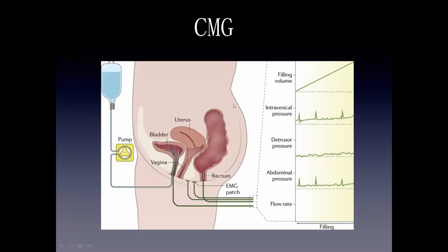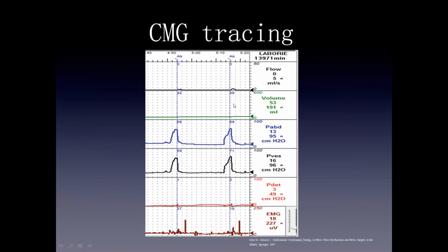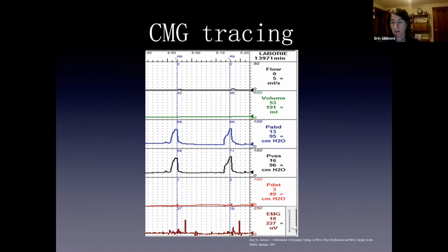Is there a time when I do ask the person to cough and do the Valsalva? Is there a specific moment? Yeah, so usually, obviously most people aren't going to leak when their bladder's pretty empty if they have stress incontinence. So once we have about 150 cc's in the person, we'll stop the filling for a second and ask them to cough and Valsalva. Then start filling them again, and then ask them again at about 250 cc's if they're able to get that high. And then ask them to cough and Valsalva sometimes at capacity when they say they're full. Those are the most common times that people are going to check.